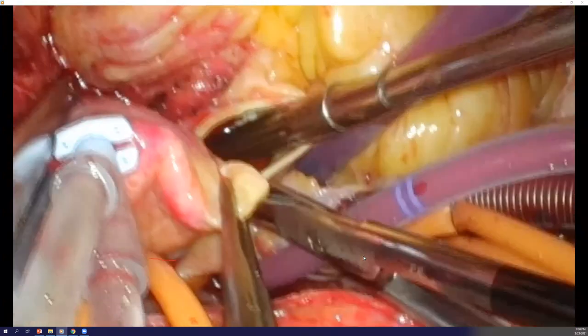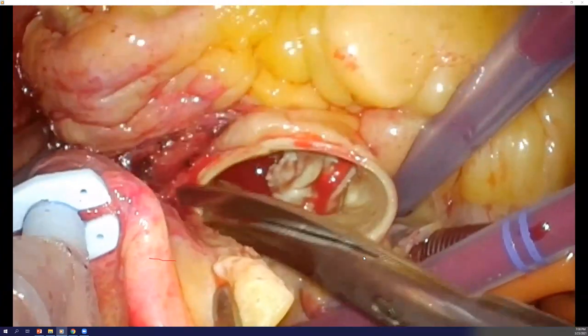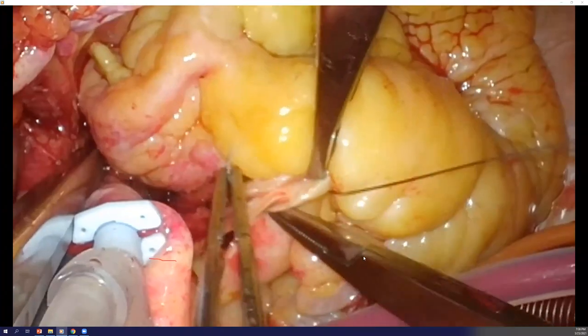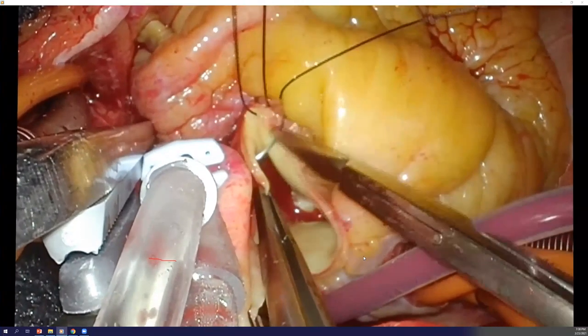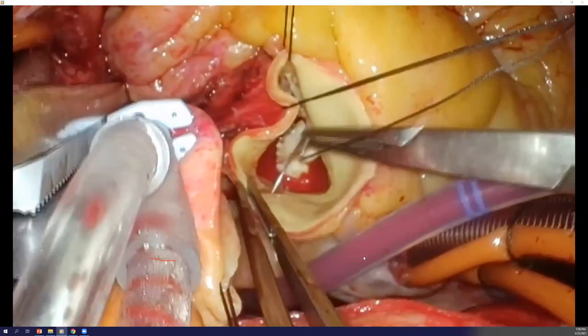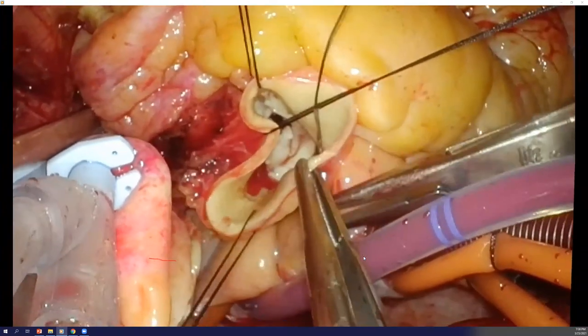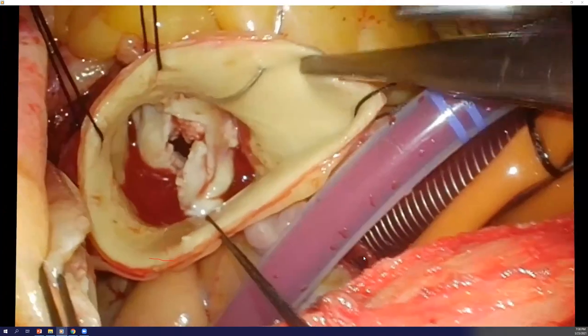No, you're great. Okay, so I like to transect the aorta. And the first thing you do when you do any root surgery is expose yourself. I use five pop-off sutures here, three above the commissures and one above each of the coronary ostia. And that really exposes the aortic root very nicely.